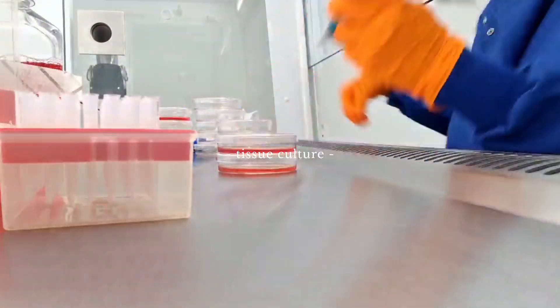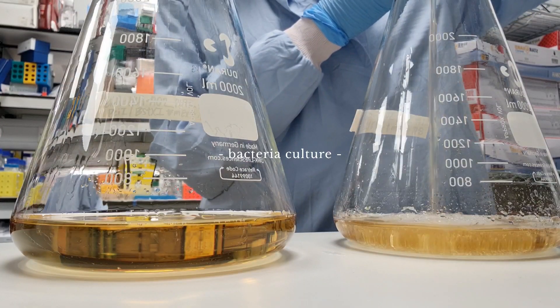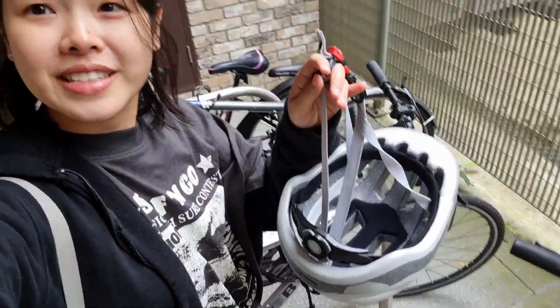Hello! It's a Sunday afternoon today and I'm heading into the lab because I need to change some media for some of the stem cells and also set up some bacteria cultures to do some maxi preps tomorrow. So I'll be cycling in today. Let's go!